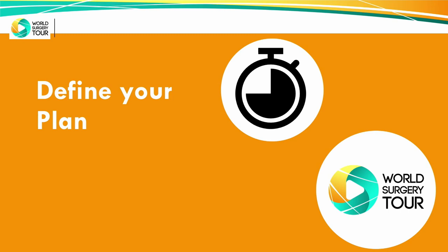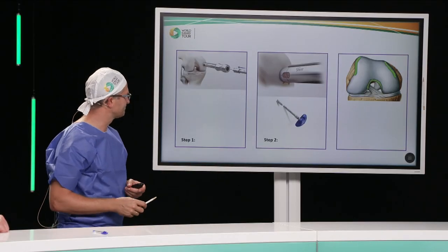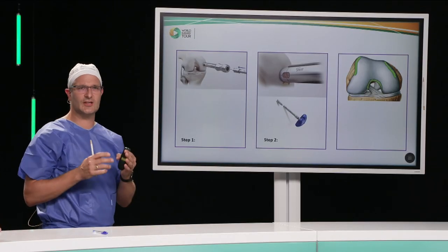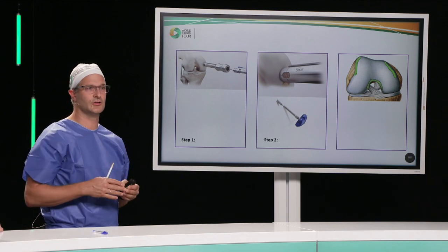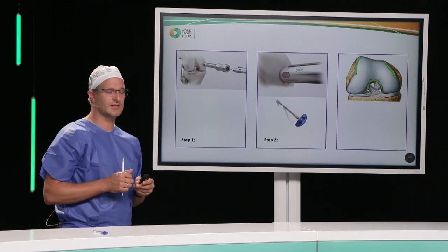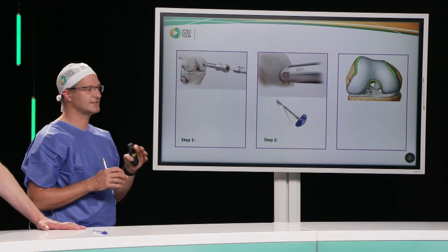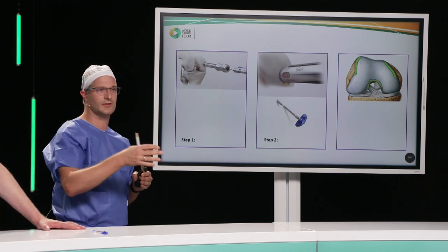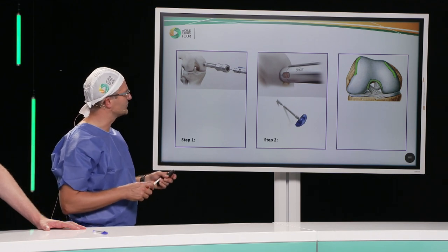So now I'm going to give you a short idea of how this procedure is done. First of all, we're going to establish an arthroscopic portal, ideally in an orthogonal direction to the defect. You can see on the left side, that's called the cartilage punch. It's a cannula that provides a stable environment to insert and remove the instrumentation you're going to need for that procedure.